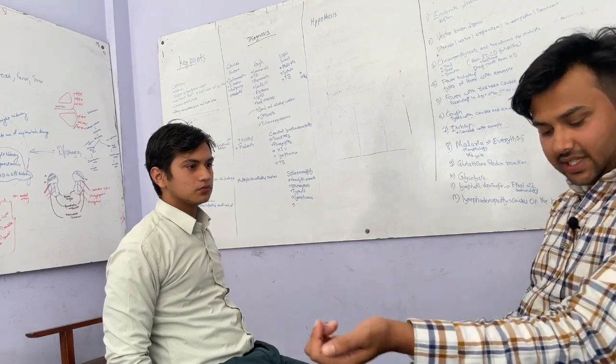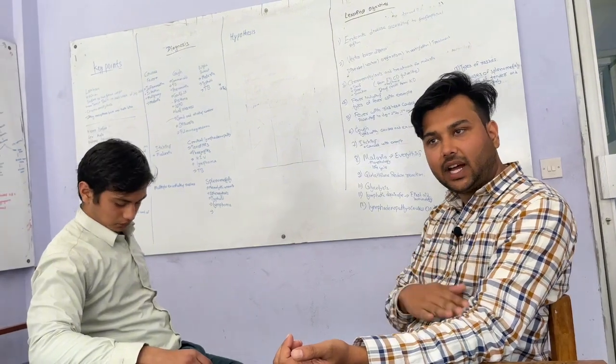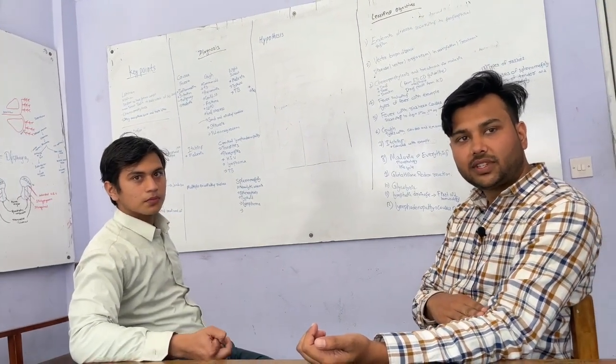And the hand of the patient is at the level of the heart. Okay? So only when the hand of the patient is at the level of the heart do you need to calculate or measure the blood pressure. Okay?